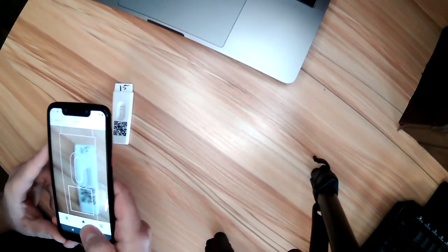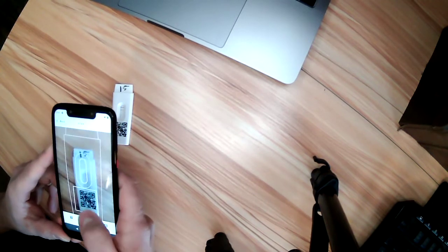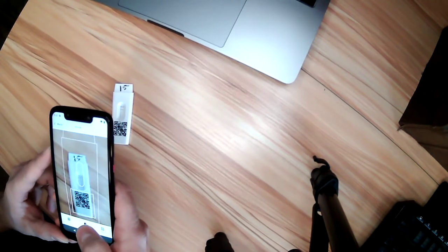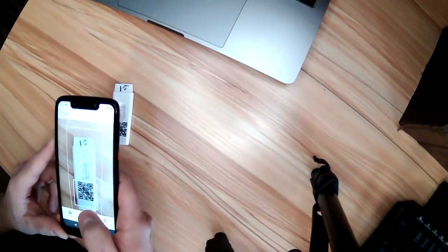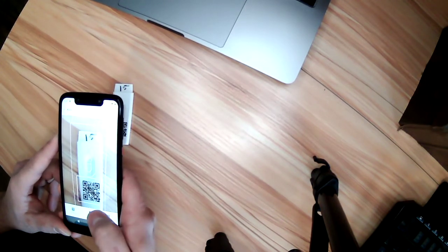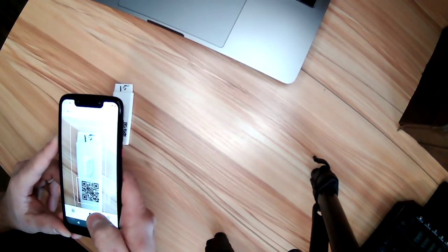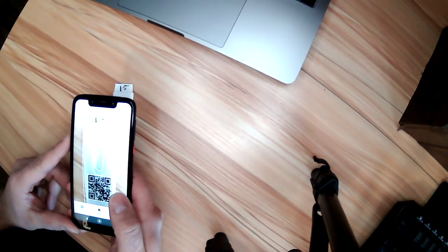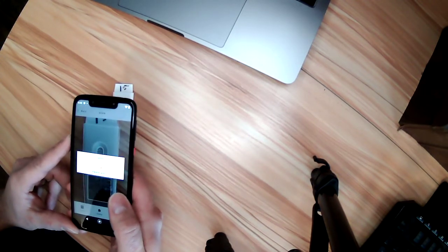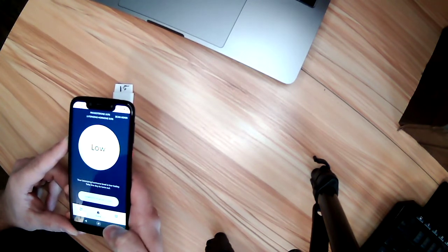So again just start at the top. The focus works, so depending on your phone type or your camera type it might help to just get the QR code in the middle and then give it a tap so the phone focuses, and then you just bring it down into place. Once you see that green, once you see the border of the box light up green, you're pretty much good to go.